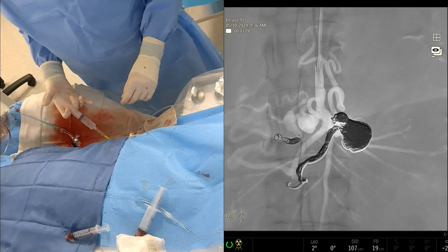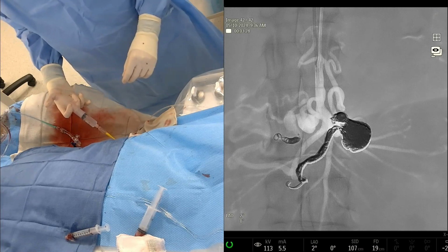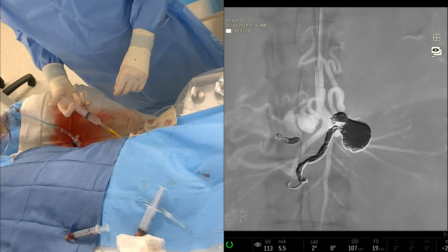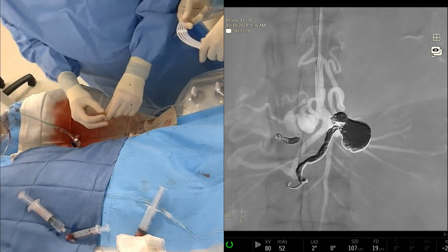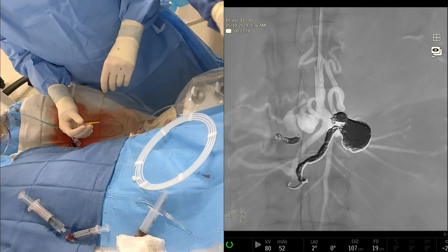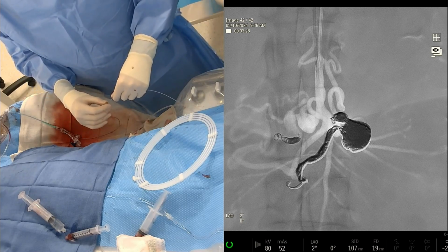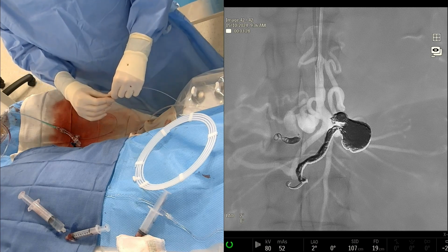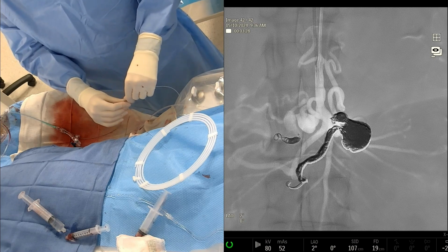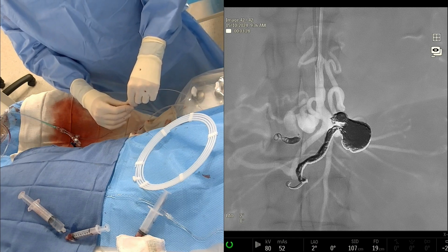Do you like your choice of microcatheter here? We talked about using Embold and having the ability to use 021, 027, different types of microcatheters. Do you like having a high flow here? If these were more difficult to get into, the high flow is nice because you can get a good robust run through the microcatheter. If we couldn't pick it off or it was too difficult to catheterize, then I think we were ready to use a low flow catheter. Probably would switch to a true select.